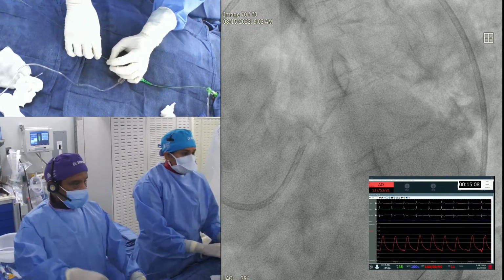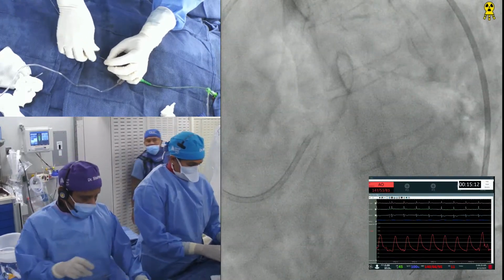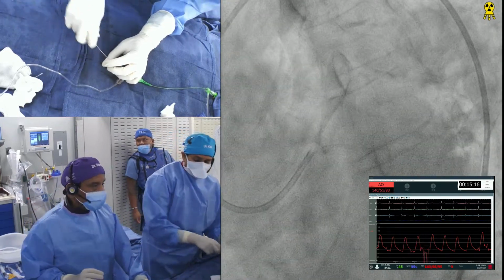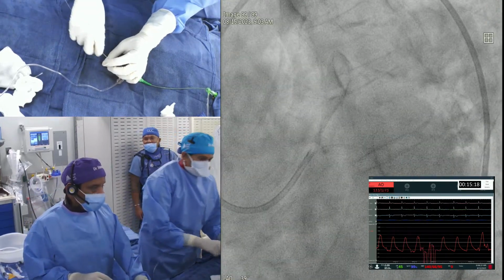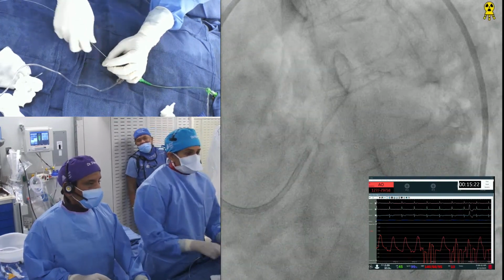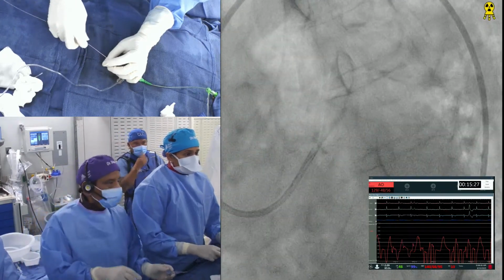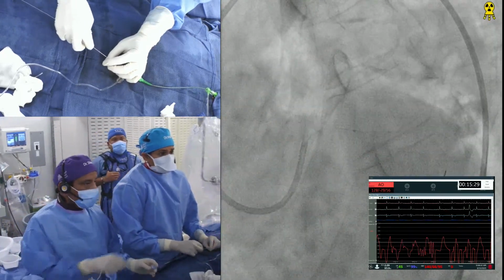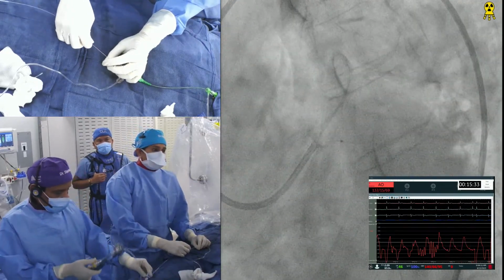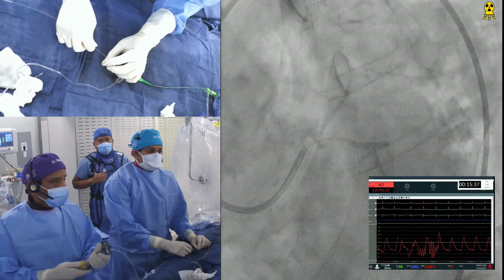Do you want to use the laser just for the sake of it, or no? No, we have to show them that we did partial rota, and partial rota will take care of the lesion. I would have wanted Godzilla, but nobody wants to. It only tells me that the rotablator did more than what we are giving it credit for.